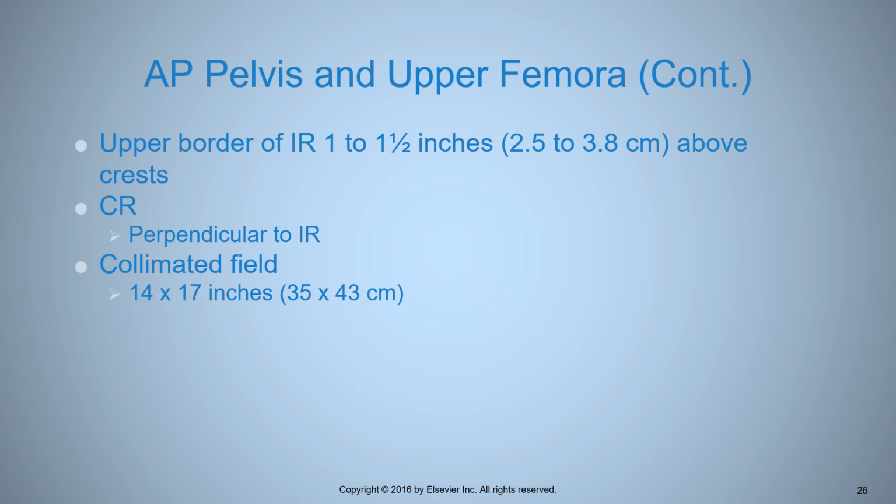When you're in a trauma situation, some of those stretchers, not the newer ones, but some of those stretchers, will have a dip in the middle where the foam is just worn out from so many patients residing in the stretcher for so long. Hospital beds are notorious for having a dip in the middle.